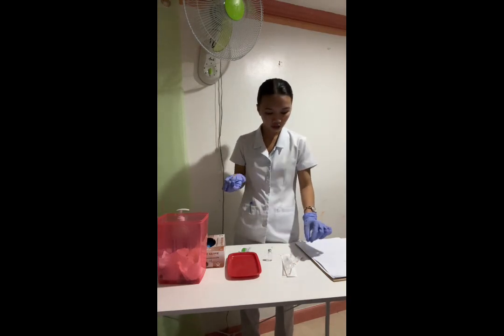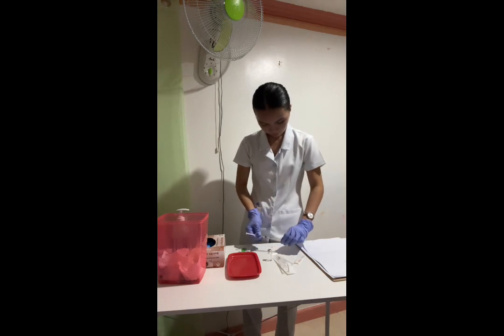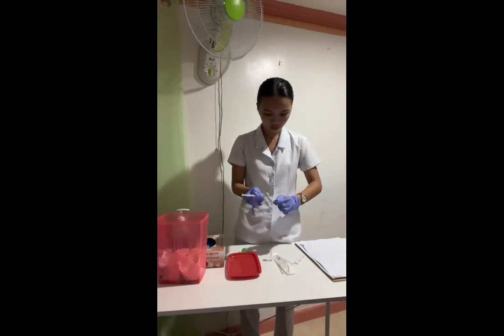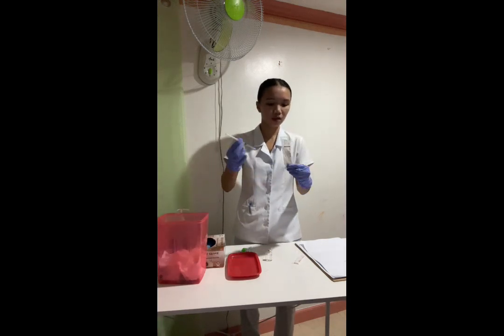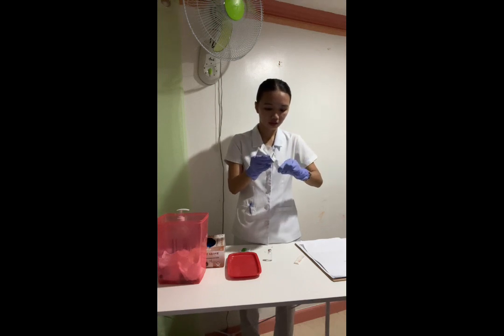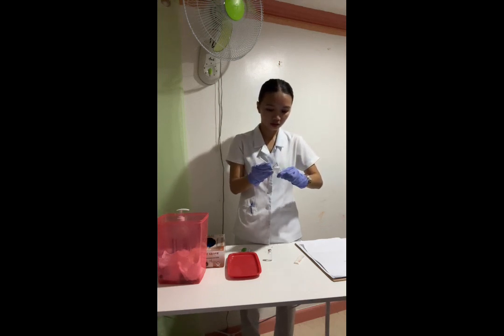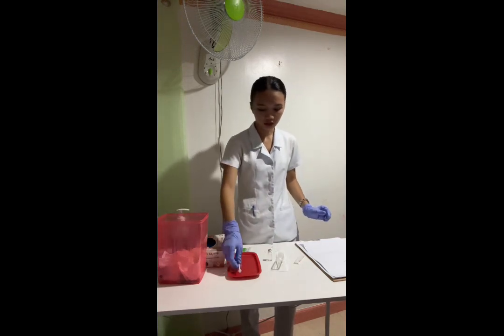Now after getting this, we are going to recap it, and then discard the filter needle and replace it with the regular needle. And then we put this in the medicine tray.